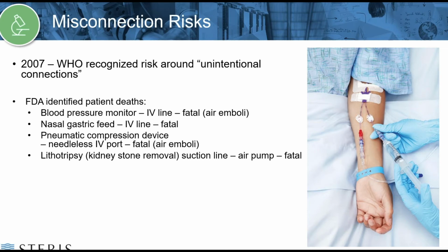So misconnection is the big risk around use of medical connectors. Back in 2007, the WHO recognized risks in relation to unintentional connection of connectors. The FDA recorded a series of associated patient deaths as a result of misconnection, with many of these cases occurring due to the connection of air supplies to IV lines. This usually resulted in a fatal air embolism, or a blockage in the vessel caused by the lodging of air.